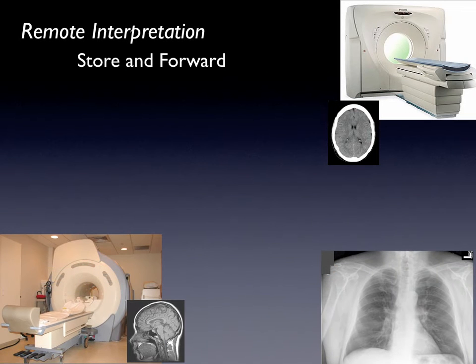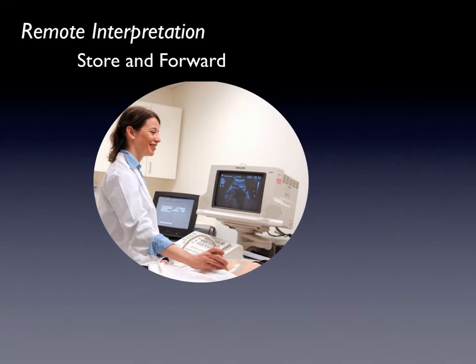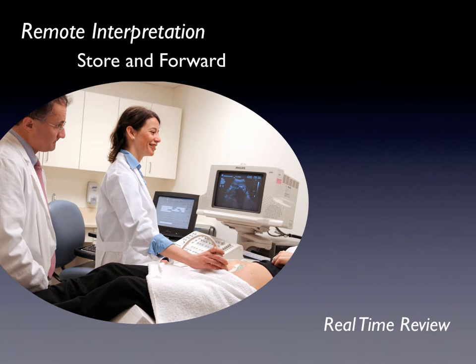This works pretty well for CT, MR, and plain film radiography. In these cases, the study has already been completed and nothing's going to change on transmission of the images. However, when you start to think about ultrasound, this examination is very dependent on a technologist. The images acquired can be very technologist dependent, and ultimately what one would really want is the ability to see over the shoulder of the technologist while the exam is being acquired.